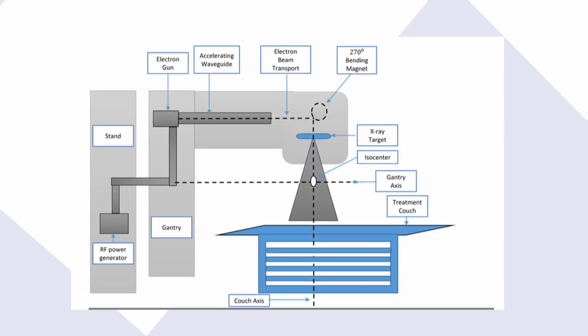The produced X-ray can be used for treatment purposes as well. The X-rays used for treatment purposes have higher energy than those used for imaging purposes.